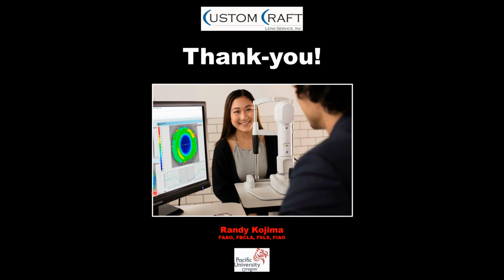Okay, and the next question I think would be directed towards Darren. They would like to know whether they need a Medmont or an Oculus to use the EyeSpace software. Another great question. And the short answer is no. We can teach you how to go in and empirically create a map using K readings, but as Randy suggested earlier in the presentation, when doing that, you lack the benefit of using the elevation data that the Medmont and the Oculus topographers provide.